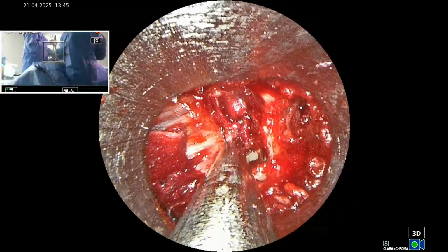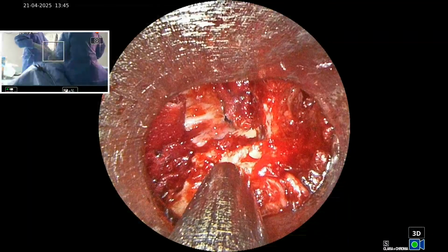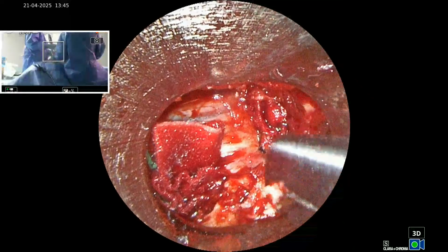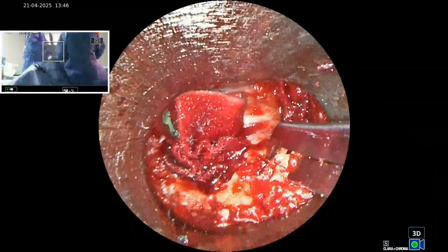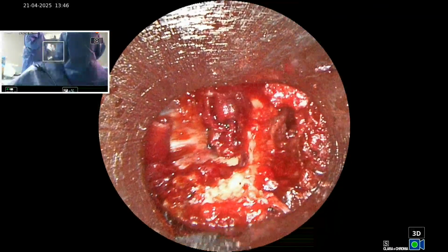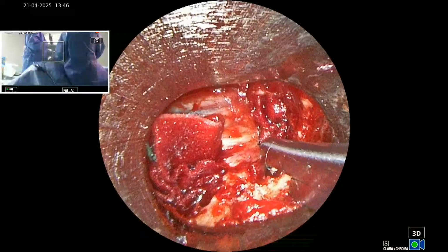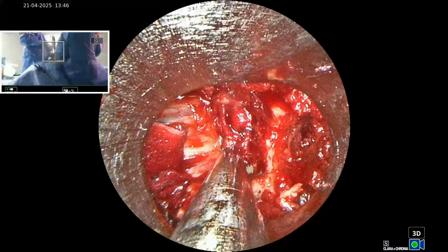Yeah, 2 mm, because it's a very tight canal. The soft tissue is adherent, almost very tightly adherent to the root, and these are my bones which are coming in my way. So for my trajectory only, yes.